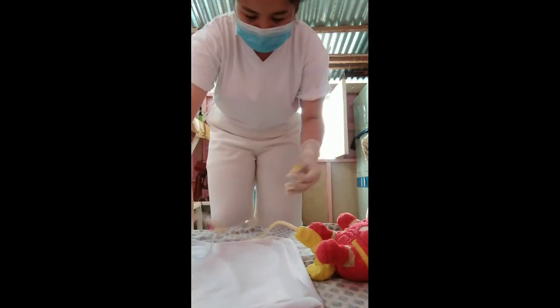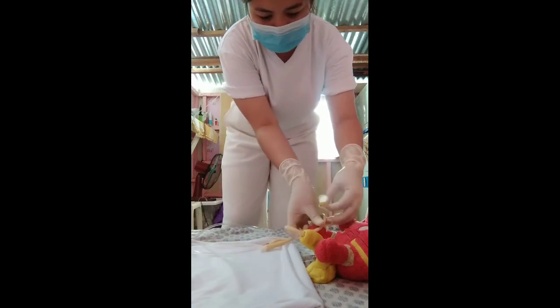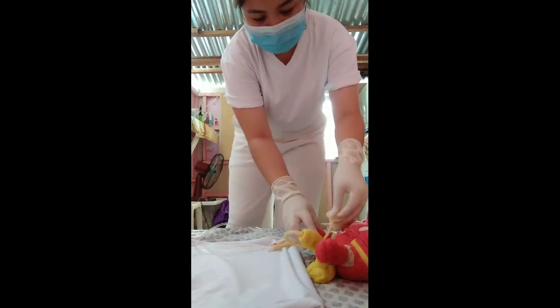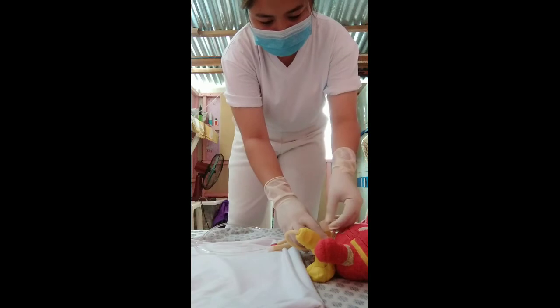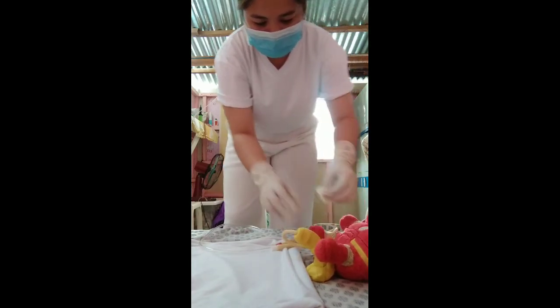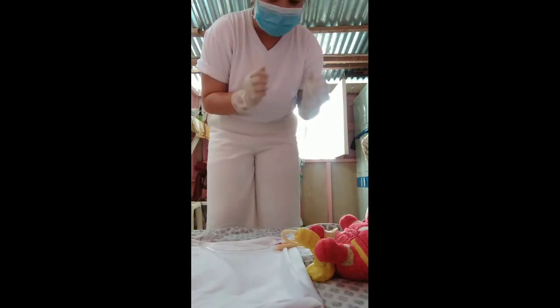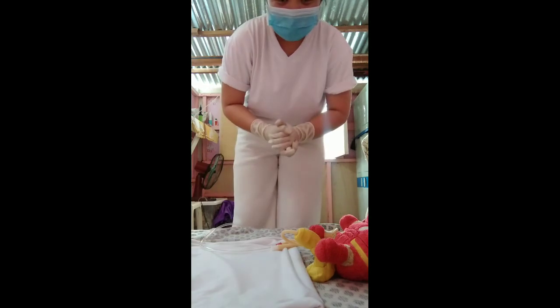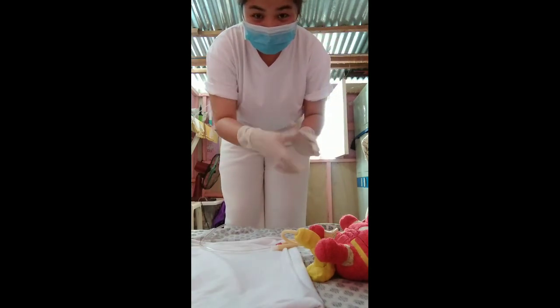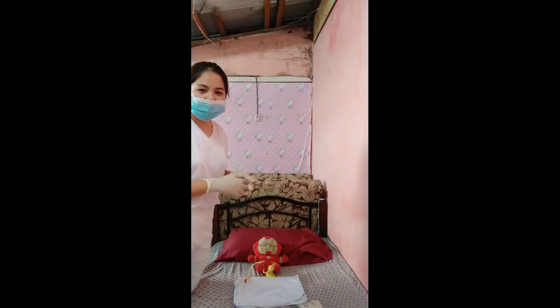We need to put this on the leg of the patient here. And perfect, sir. You are done. So we are done inserting the catheter into the urethra of the patient.